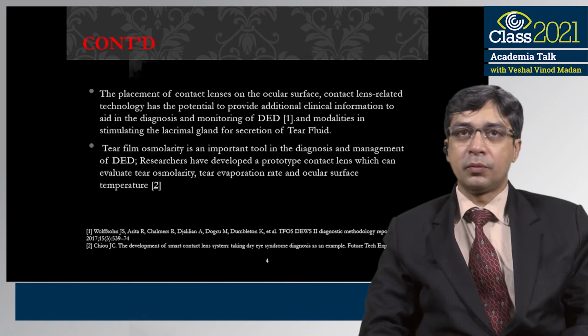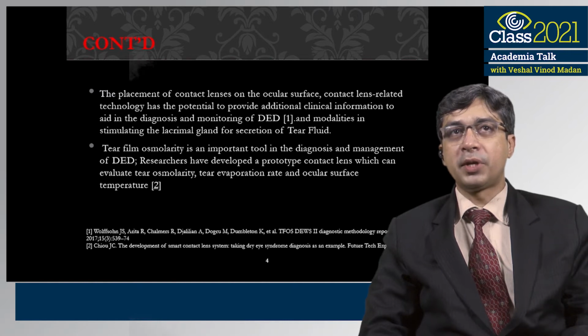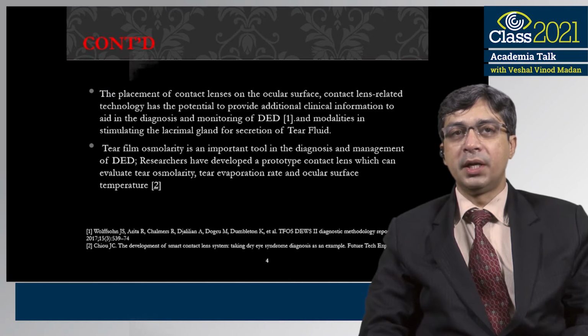Tear film and its properties, such as osmolarity, are an important tool in the diagnosis and management of dry eye disease. Researchers have developed a prototype contact lens which can evaluate osmolarity, tear evaporation rate, and ocular surface temperature, which all together aid in diagnosing dry eye disease.